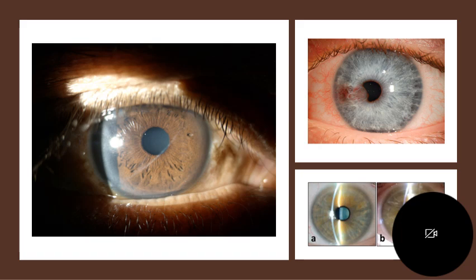Now let's look on the top right-hand side. This is diffuse illumination of the anterior segment using the slit lamp. What can you see using this form of illumination? And now look on the bottom right. This is a thin slit beam at an angle, and that thin slit beam at an angle is able to visualize multiple layers: the cornea, the iris, and the lens behind it. Can you see one pathology that is there in that bottom picture?